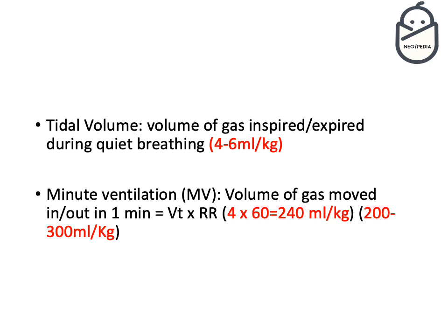That's really important because in the next slides we are going to explain why it's important to remember these figures: 200 to 300 mL per kilo, or 0.2 to 0.3 liter per kilogram. That's really important.